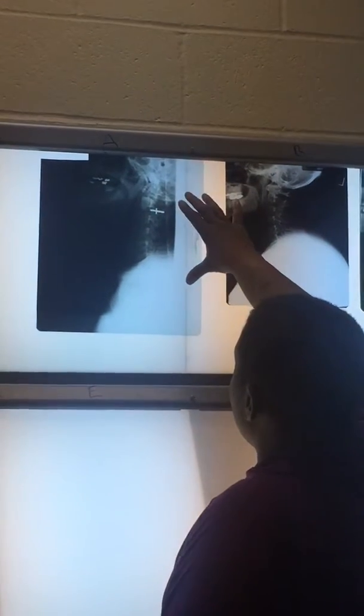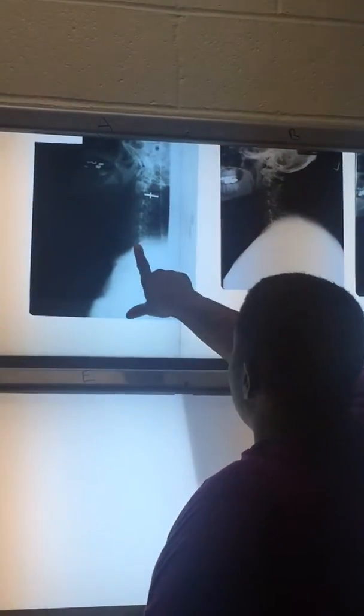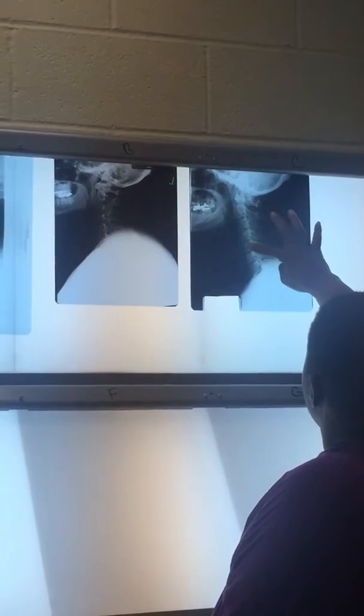This one, you see 2, 3, 4, 5, 6. This one, 1, 2, 3, 4, 5, that's 6. If you got 7, they don't have T1. If I ask vertebrae versus cervical, then you know it's just all 7 cervical on this one, but not on that one. I think both of those are 6. Most are 6 because they rotated and they got covered in 1.